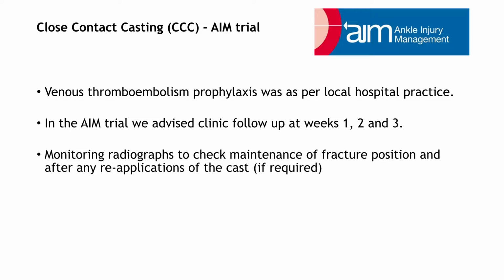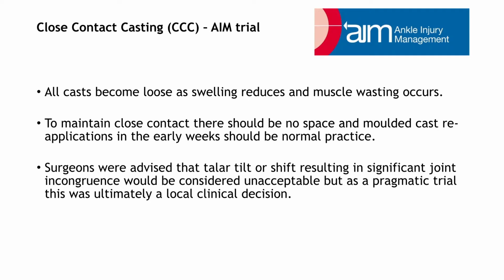Radiographs are also repeated if reapplication of a moulded cast is required. Professor Willett has highlighted that there is less focus on cast management for unstable ankle fractures in contemporary practice in the UK, so we emphasise the need to monitor these casts.